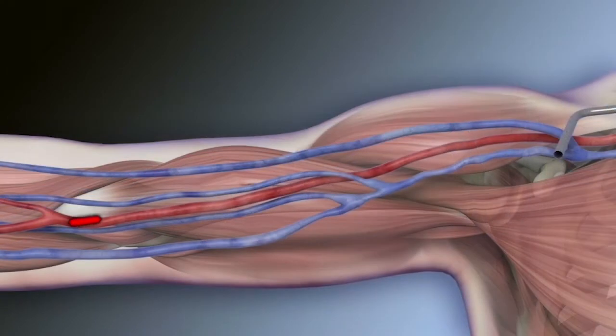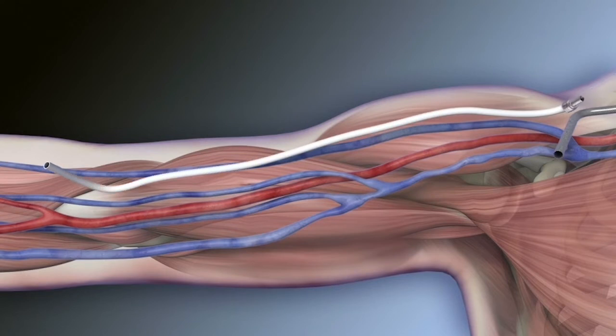Make an incision at the target artery site and expose artery. Tunnel the graft from the DPG incision to the arterial incision site, utilizing the graft markings to avoid twisting the graft.